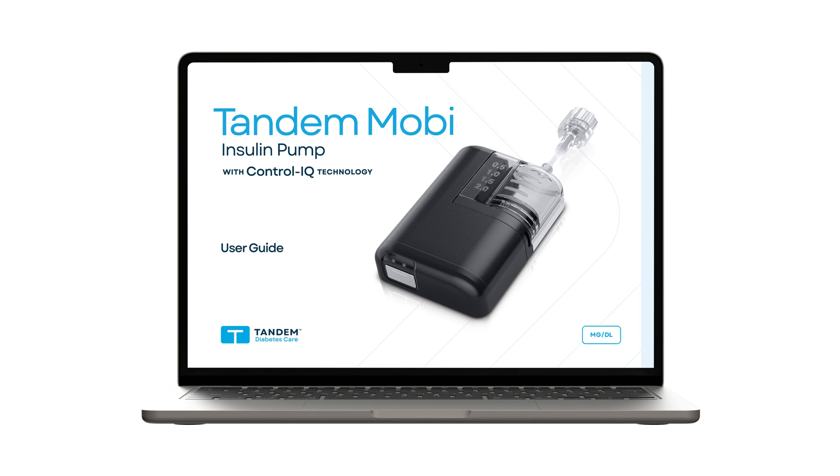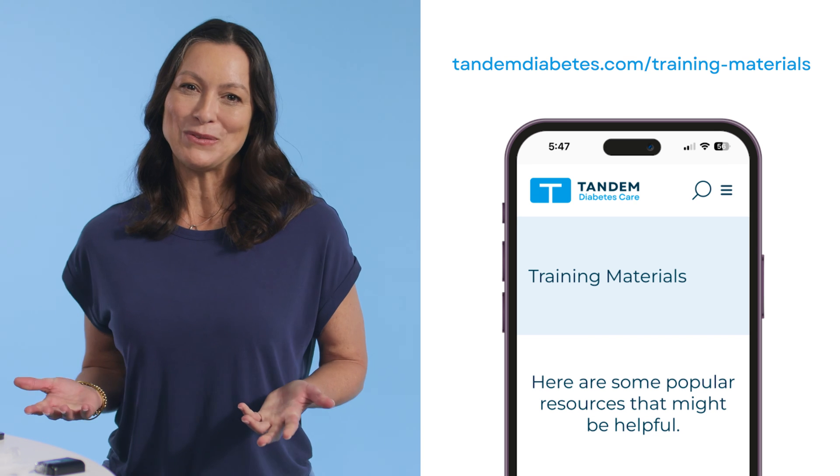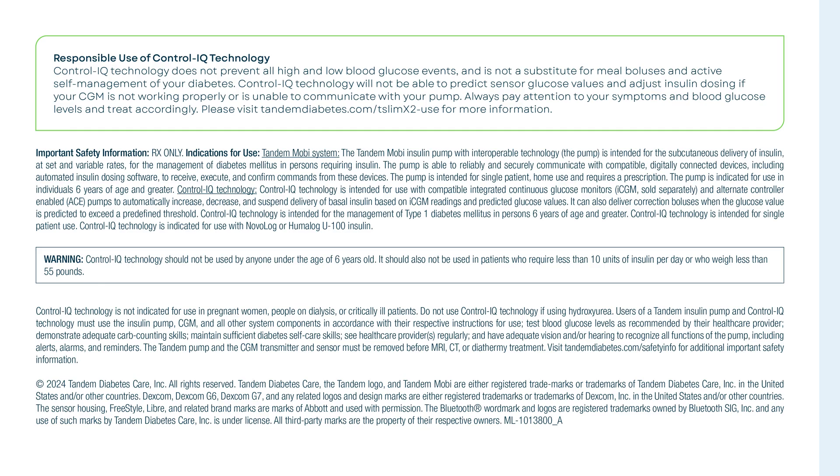For complete details, see the Tandem Mobi Insulin Pump User Guide. Be aware that some skin care products such as lotions, sunscreens, and insect repellents can cause cracks in the plastic of the cartridge or pump. Do not allow these products to come into contact with the pump or cartridge. Remember to always wash your hands before handling your pump or cartridge after using these types of products. For more helpful resources, visit the pump training section of our website at www.tandemdiabetes.com.